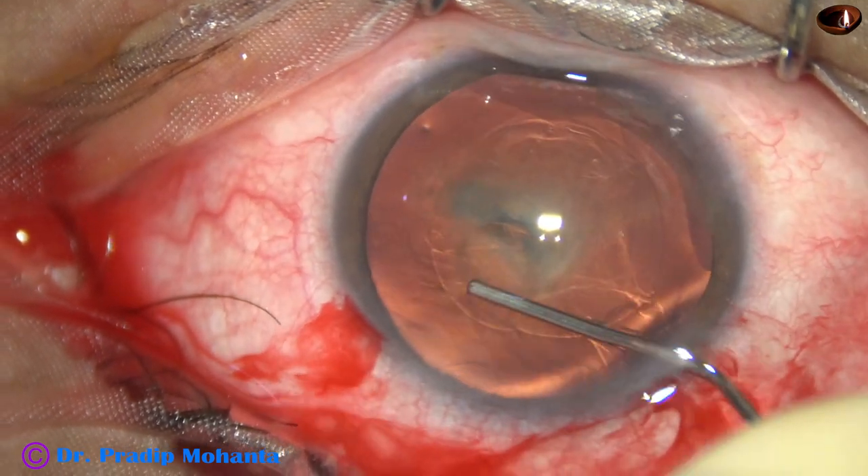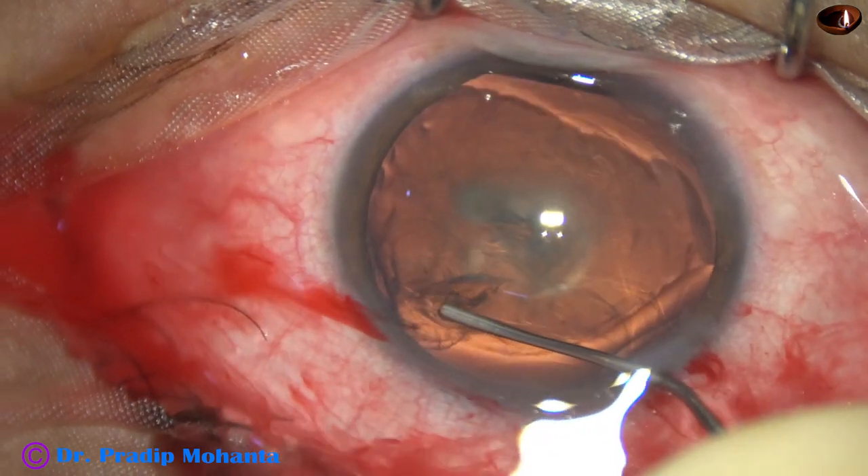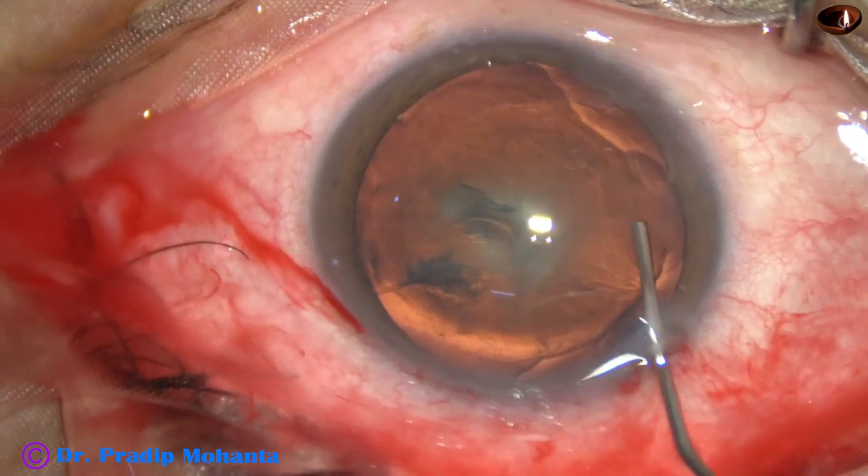Now hydrodissection. Very gently hydrodissection is done and hydrodelineation is attempted.